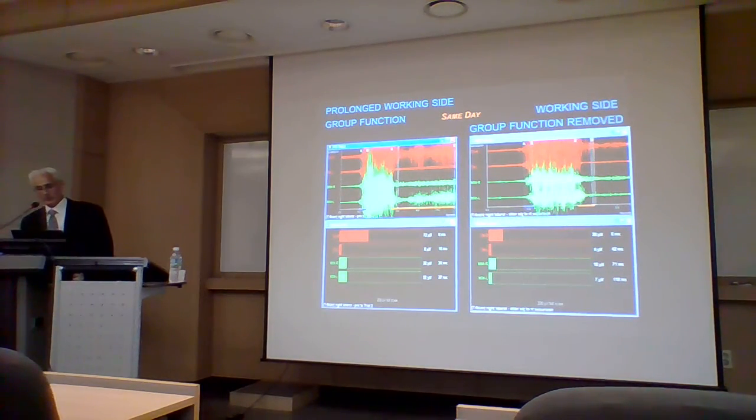So if you compare the pre-op to the post-op, dramatically less muscle activity. 줄어든 게 보이죠? And this, of course, lessened her headaches, lessened her jaw pain, lessened her overall symptom condition.